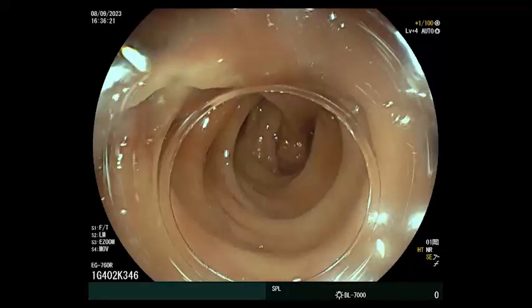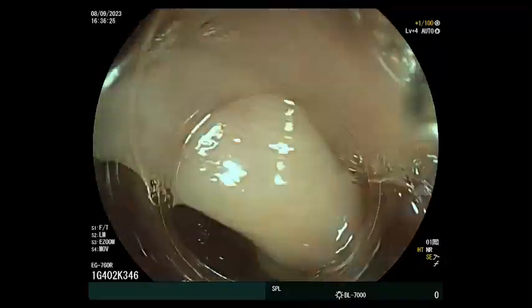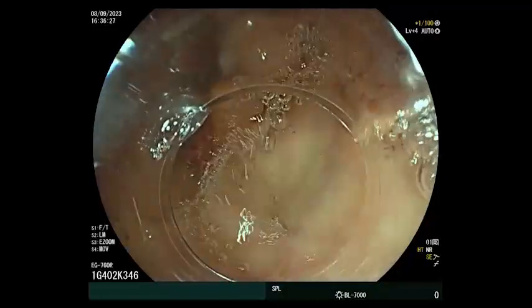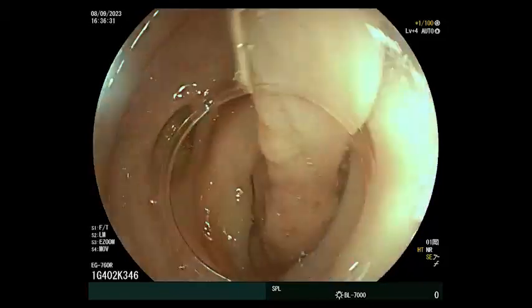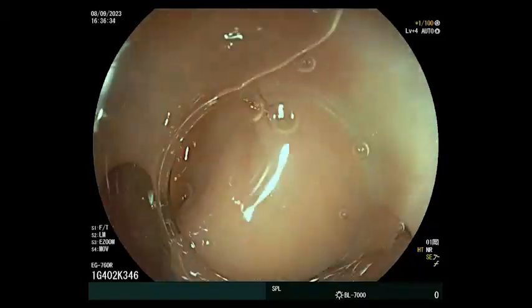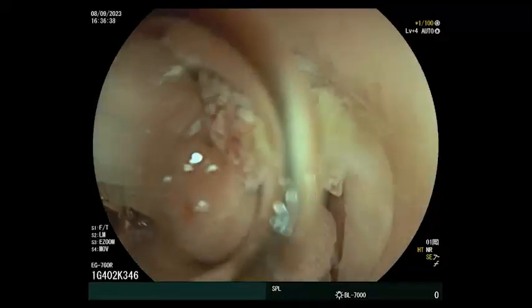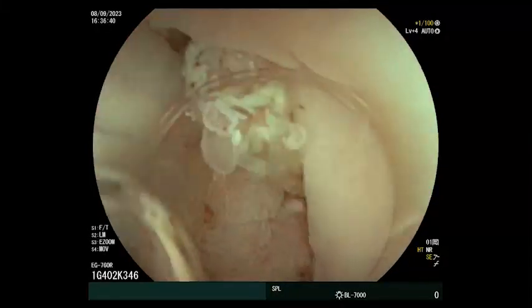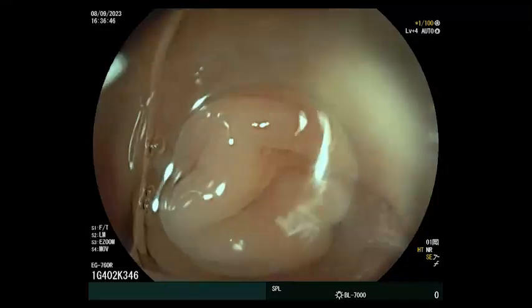And then as we move outwards, there is another one. It's also a large one, but it's smaller than the proximal one. So we will start with this one. According to guidelines, if we are seeing a pedunculated polyp like this one with a thick pedicle, what do you think, Shaima? I think you prefer to do mechanical compression for this pedicle?